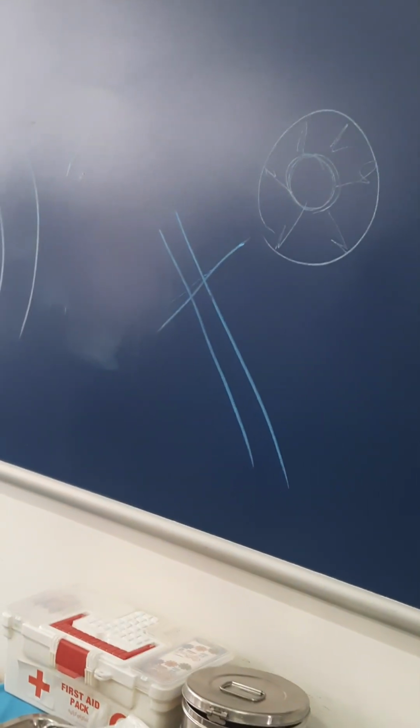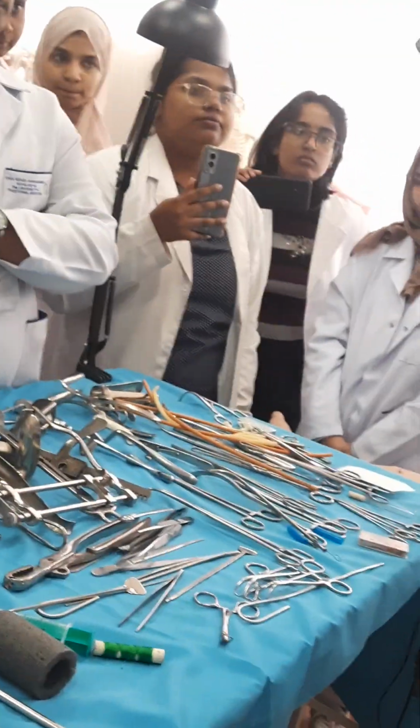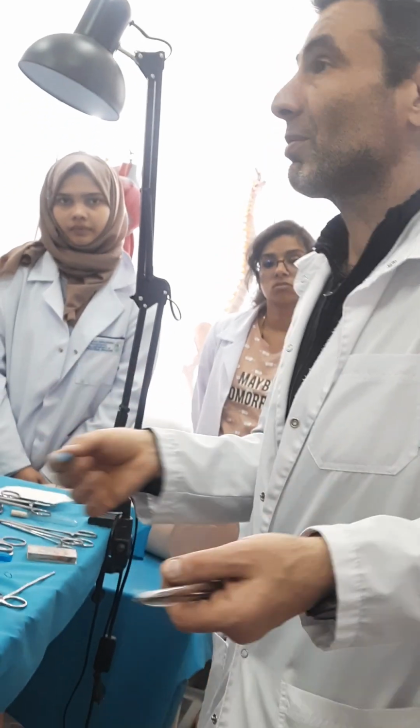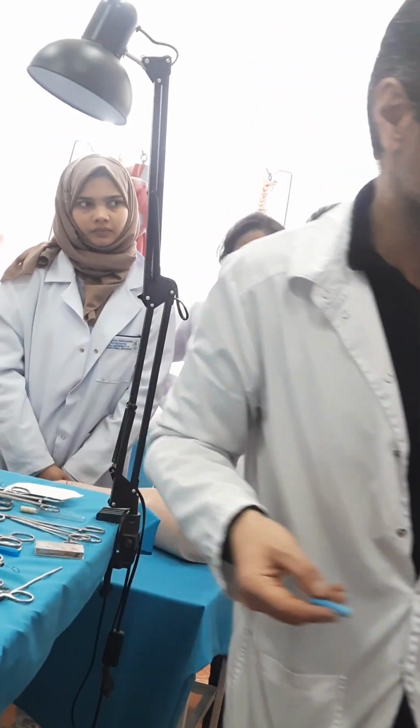If you try to make such a suture for the intestinal wall, fibers will come to the outside, and it gives formation of peritonitis. For skin, no problem. For muscles, no problem. But not for the whole organs. Not for the whole organs.